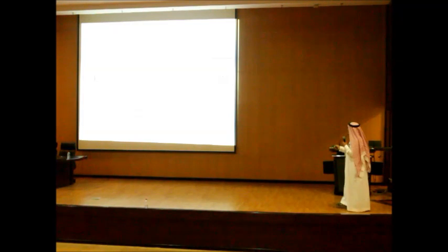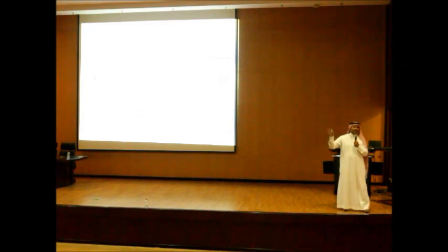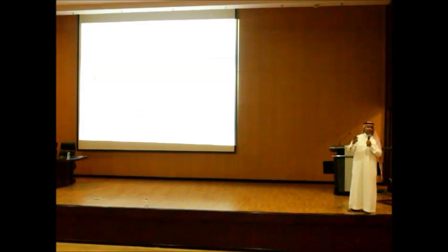Now we go to the most ominous and dangerous type, third degree heart block. So simply, we have complete heart block. And the heart rate will be slow. If you have any patient with heart block, don't expect a heart rate of 90 or 70 or 60. The heart rate will always be at this low level, right?